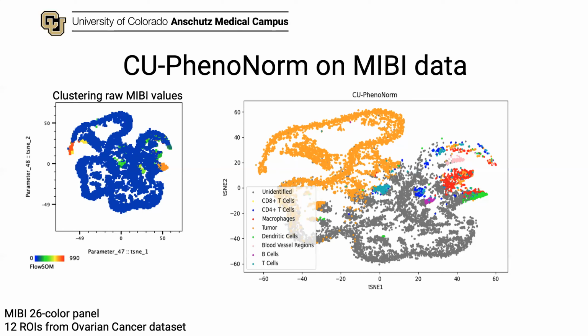So yes, Mansouri and I went through and said, okay, this population has CD3 and CD8. That means it's a CD8 T cell. It's not expressing some of the macrophage markers, et cetera. So it was kind of manual. Coming up with the names for each cluster and what those cell types are is a manual process. Got it. Thanks.